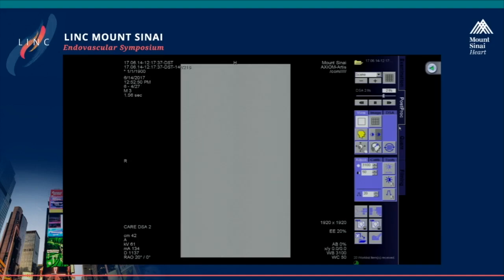And to Brian's point, if you see the pre-shot versus the post, the flow is torrential at this stage. And we were very happy, like Dr. Coombs said, that we did not lose that collateral as well. So overall, it will be okay. Here it would be very interesting to have, for example, these devices that Dr. Montero Baker showed, where we know exactly the oxygen saturation, and then we could decide to go forward or to stop here. Okay, perfect discussion.